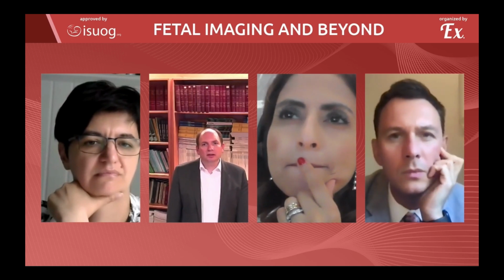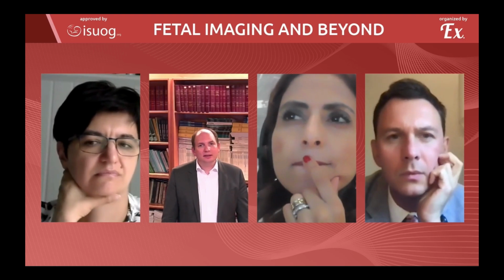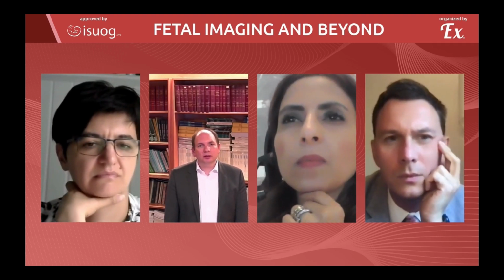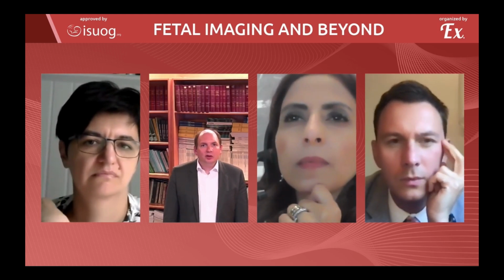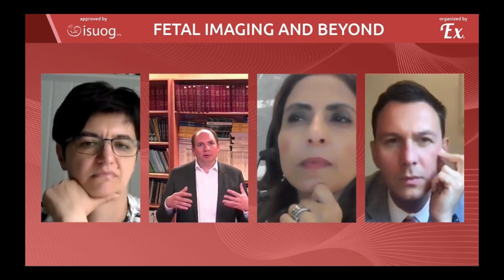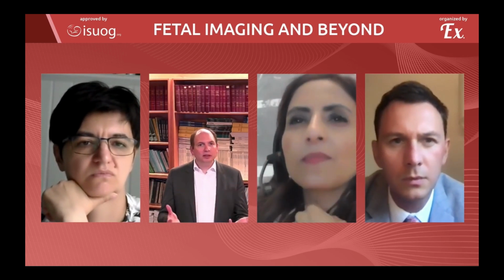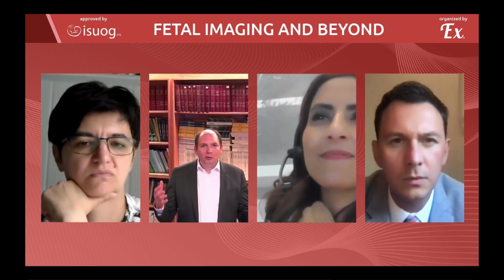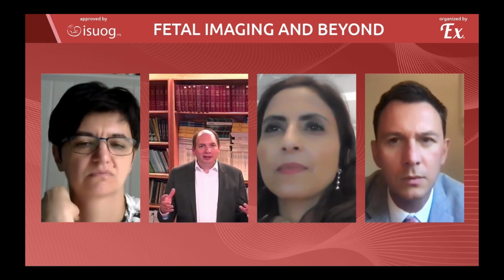No, I would trust the postnatal imaging. In that case, it's important to review the images on MRI. A lot of people feel that MRI has no artifacts and is always brilliant. We also here in Vienna have a certain fraction, fortunately not too many, of catastrophic quality MRIs where we are totally unhappy with those.